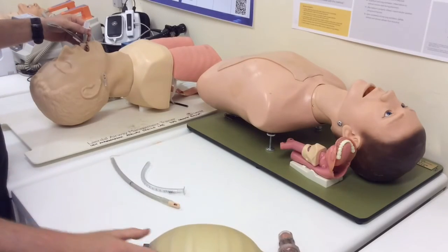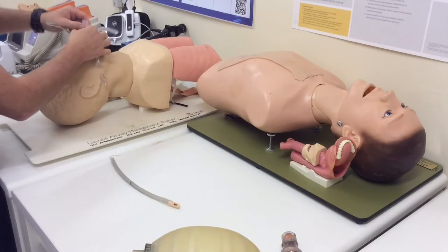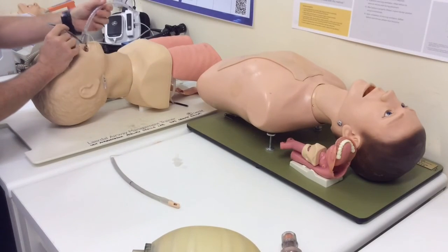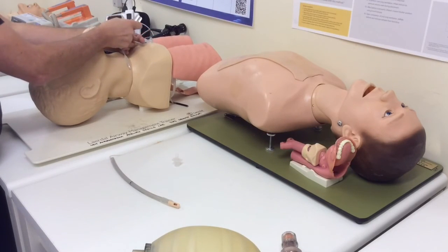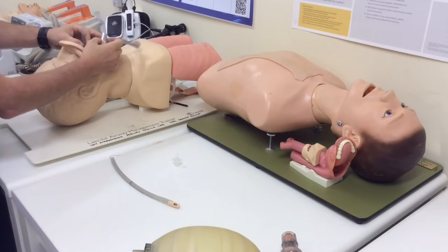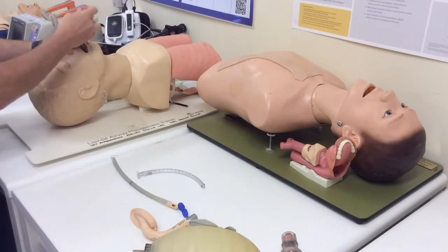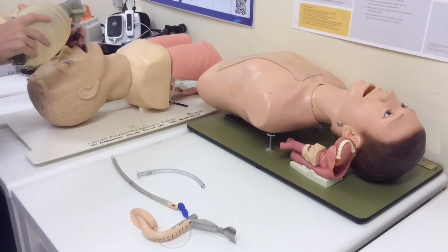If down the line I want to remove this rather rigid supraglottic portion, then I can use the push rod. So I pop out the endotracheal tube connector and put it where I can reach it and where I won't lose it. I use the push rod to hold the ET tube in the same place while I'm bringing the supraglottic airway out, following the curvature of the airway once again. As soon as I can grab the tube, I hold it there, and then importantly, you need to remove this push rod so that the pilot balloon can go through the LMA portion, put your connector back in, re-inflate your pilot balloon, and then we can ventilate again.